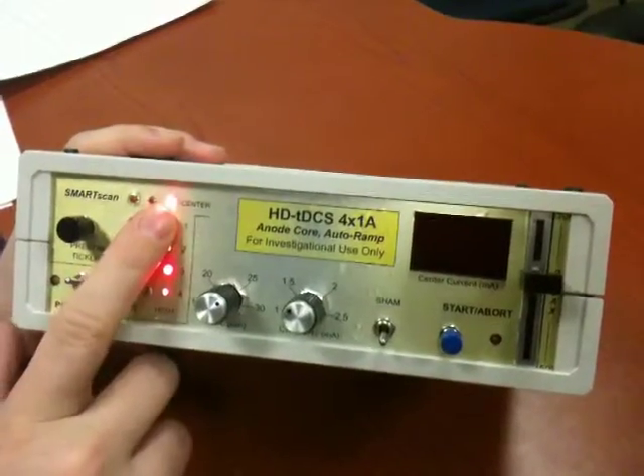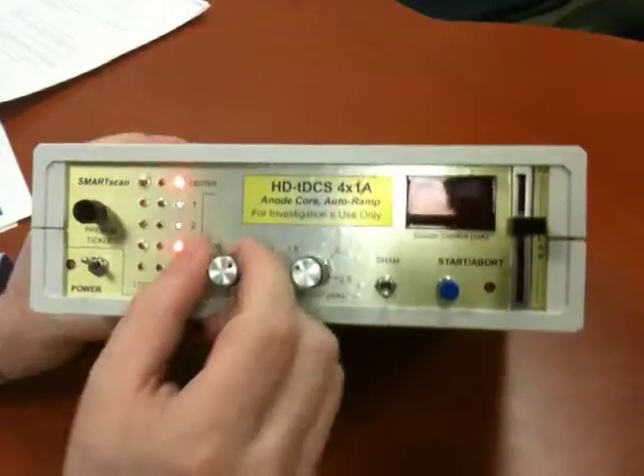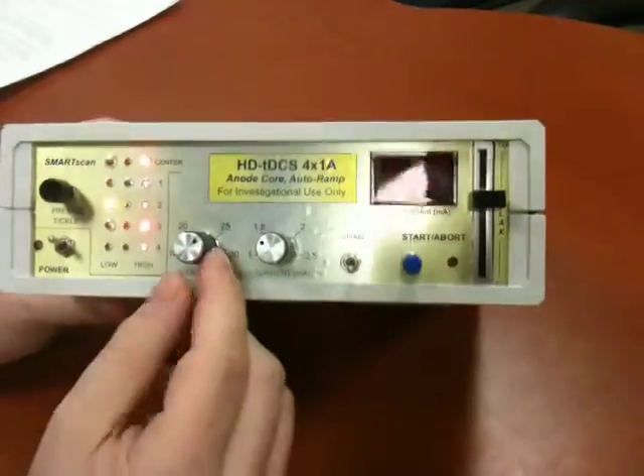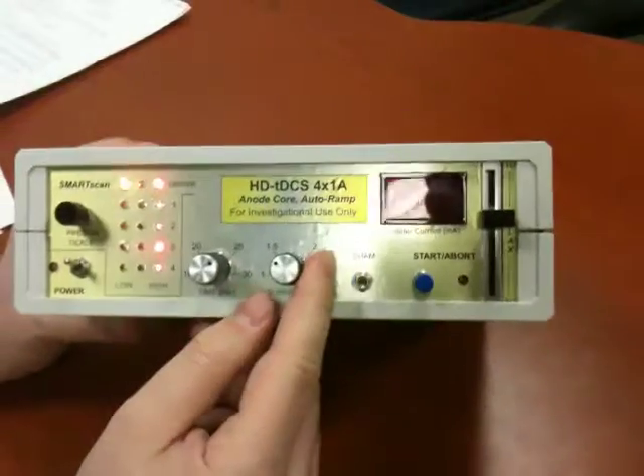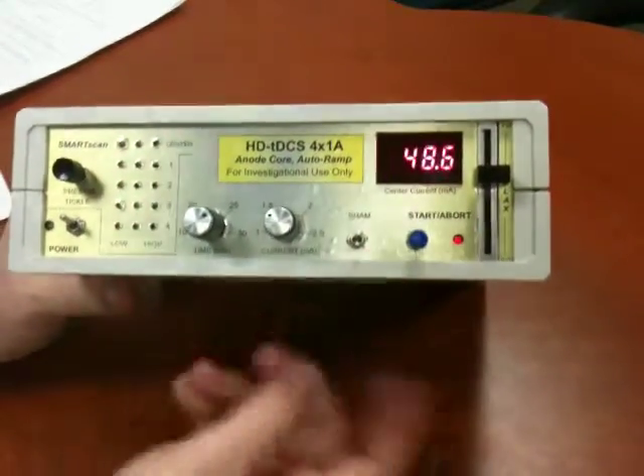The light's not going on — it's on now, there it goes. So that's it. There are some very simple features here: time, current, and there's a sham option if you want to engage it or not, then you start.